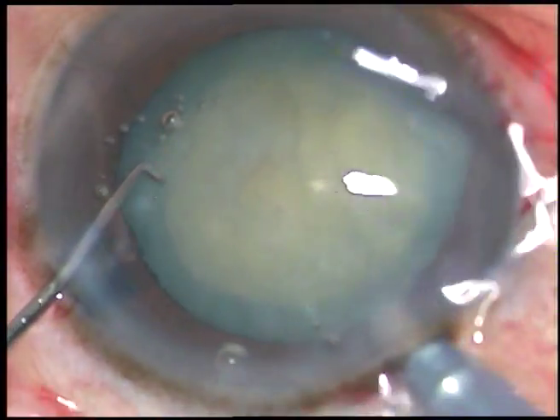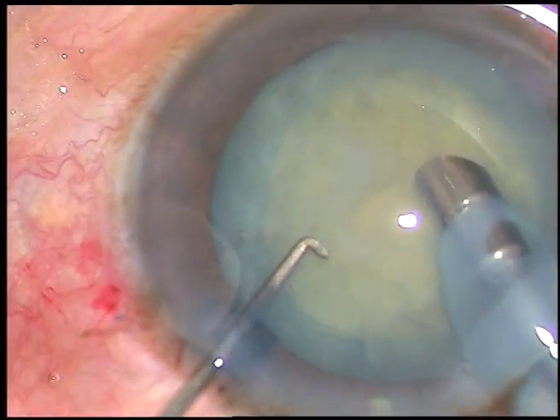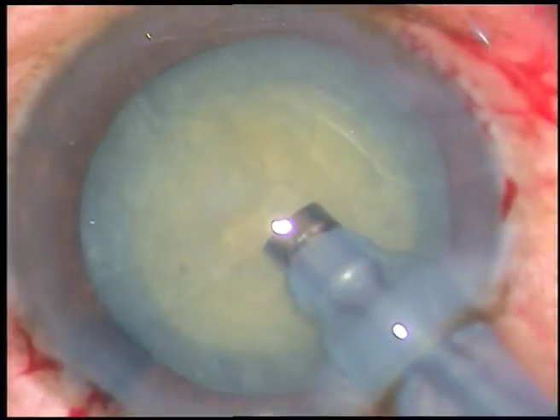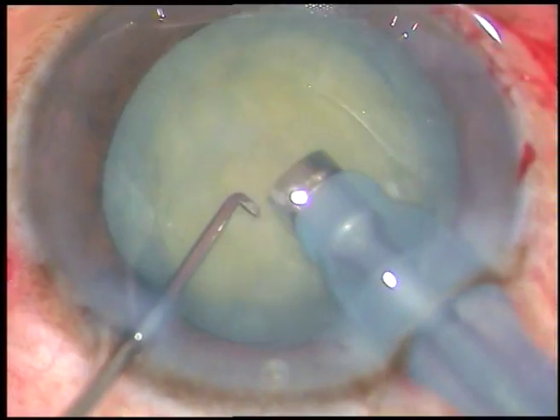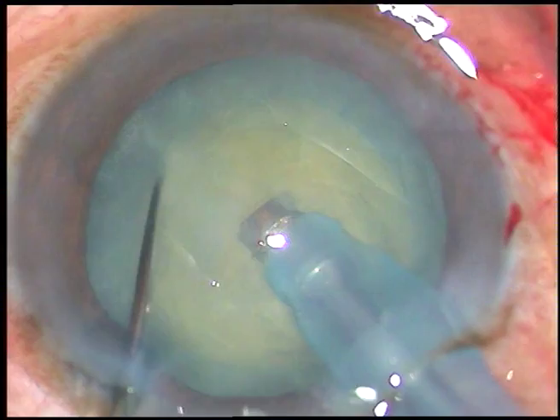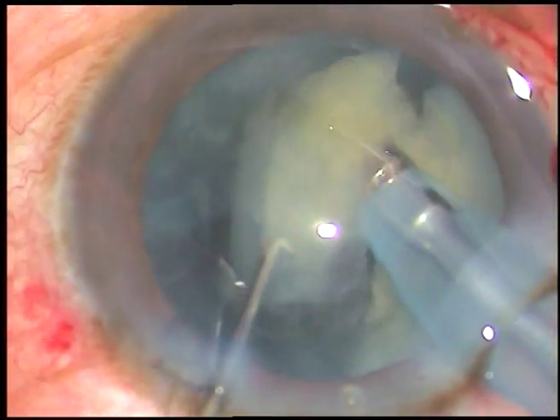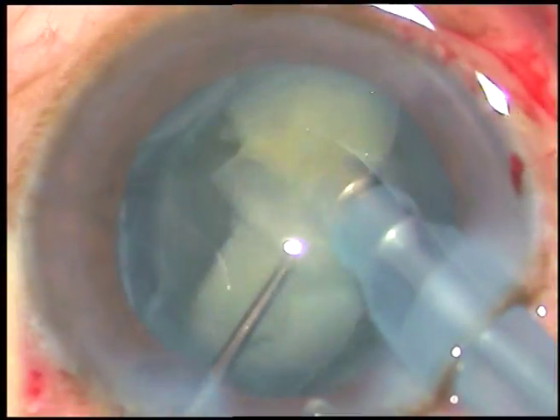Hydrodissection is not required. The tip of the phaco handpiece is introduced and some cortical matter is again removed to improve visibility. Now this is direct chop — the cataract in this case is brittle, not very hard. Just bury the tip into the substance of the nucleus, hold it firmly and chop it. This cataract is very brittle and it is getting chopped and emulsified very easily.